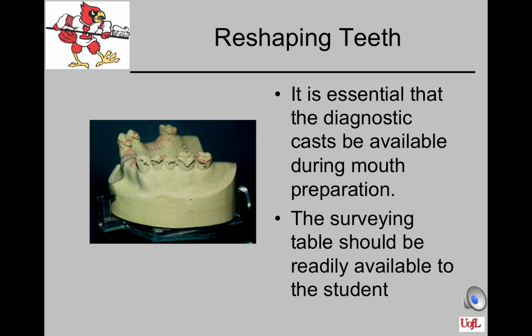When you come into the clinic to do mouth preparation or reshaping the teeth, it's absolutely essential that you bring your diagnostic cast and that they be available during mouth preparation. Also, the surveying table should be readily available to you so that after you do some mouth preparation, you can take a quick snap impression, pour it up, and in 5 minutes look at what you have achieved and see whether additional reduction is needed.